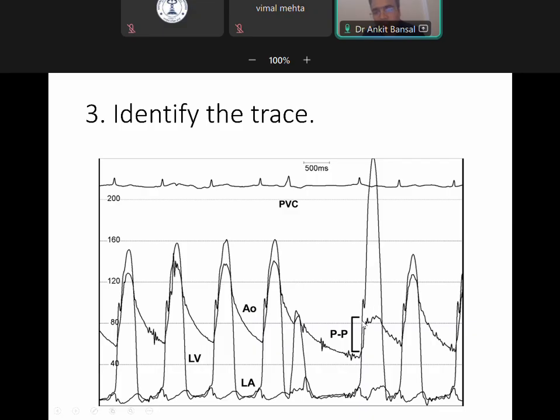Systolic pressure is coming down. See, the systolic pressure has almost become half here. Pulse pressure is narrow despite the diastolic pressure being low compared to here. So are you understanding? Am I clear or not? If I am clear, then I can go ahead.